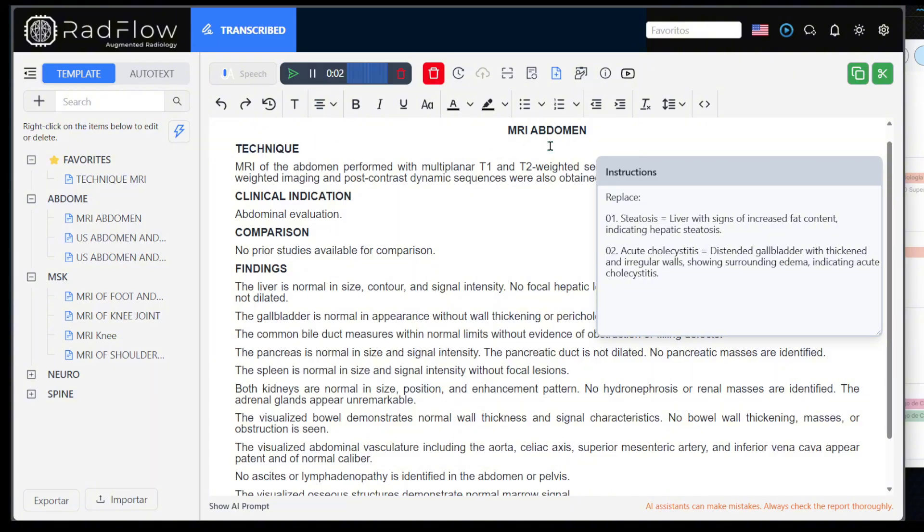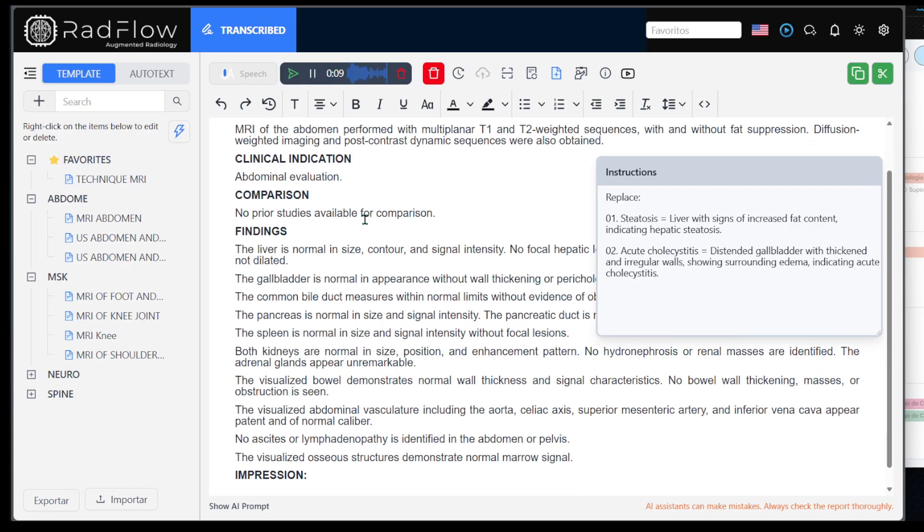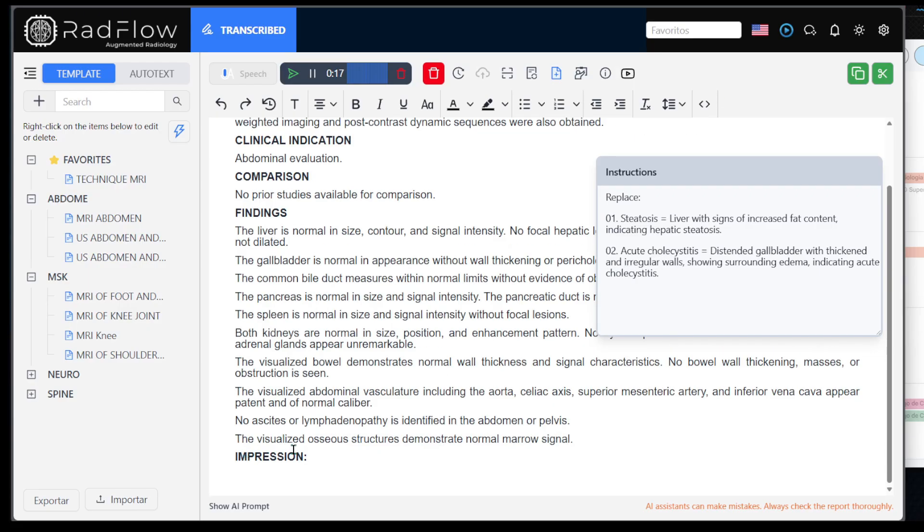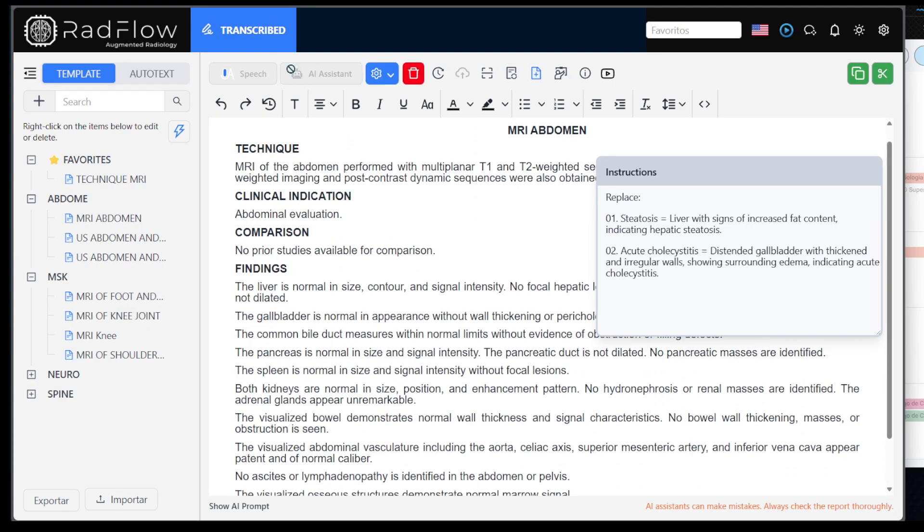Assistant, help me with this abdominal MRI for the suspected clinical indication of acute cholecystitis. Please include item 1 for steatosis and item 2 for acute cholecystitis. Also help me with the diagnostic impressions. Thank you.